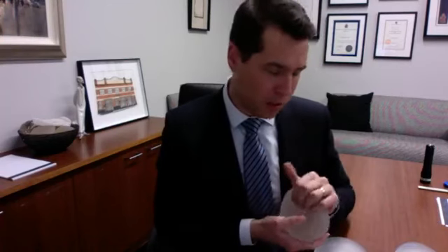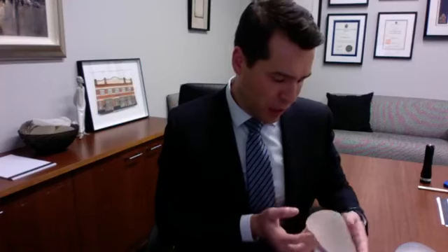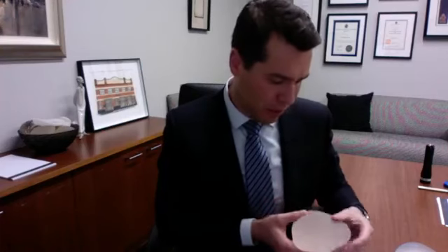The implants that I personally use these days are a combination of micro-textured implants, which are the Mentor implants. If I'm needing to create shape and someone's wanting a natural shape, it's a common implant for me to use in breast reconstruction or for postpartum rejuvenation in terms of fixing up an empty skin envelope. Useful in breast reconstruction after massive weight loss as well.